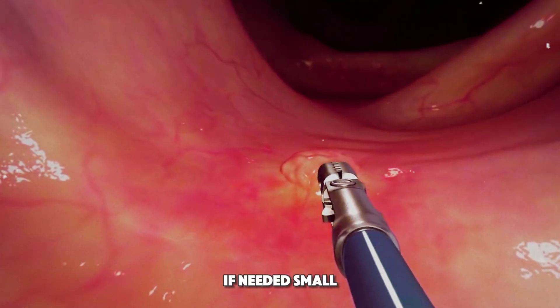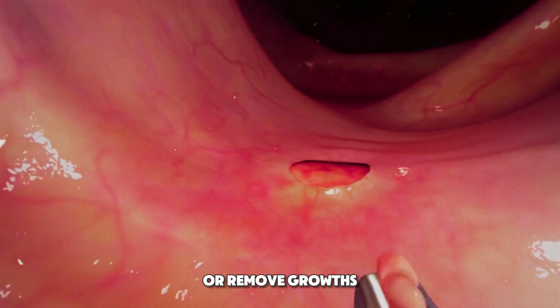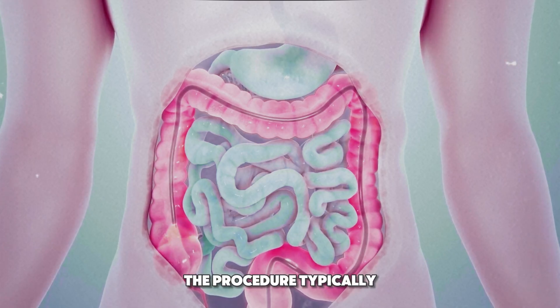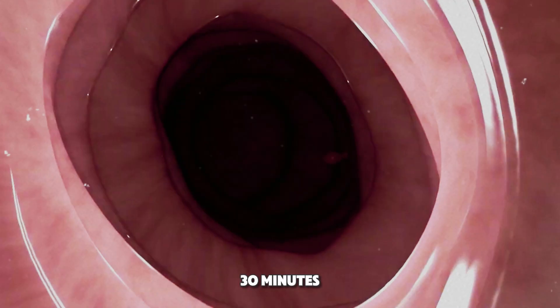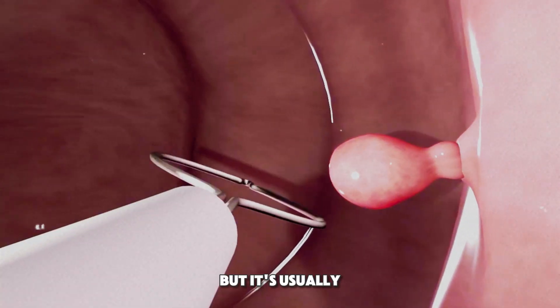If needed, small tools can be passed through the scope to take samples or remove growths. The procedure typically takes 20 to 30 minutes. You may feel some pressure or mild cramping, but it's usually not painful.